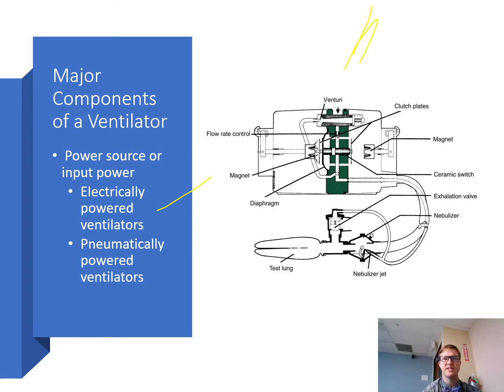So the gas sources and mixtures of air and oxygen supply the power for the ventilator to function, and they allow for various FiO2 concentrations, but the electrical power is required to operate the computer microprocessors, the controls, the capacitors, the solenoids, the electrical switches, the phasing of the ventilator, regulating the inspiration and allowing the patient to exhale. And it even monitors the gas flow and controls the gas flow.